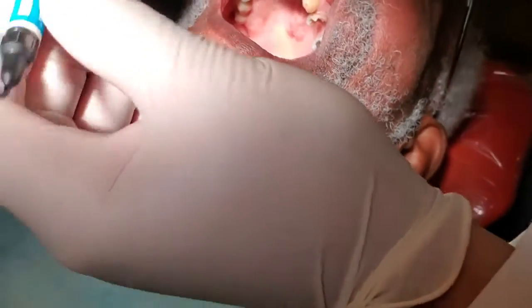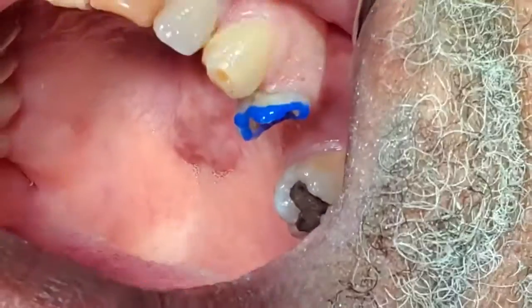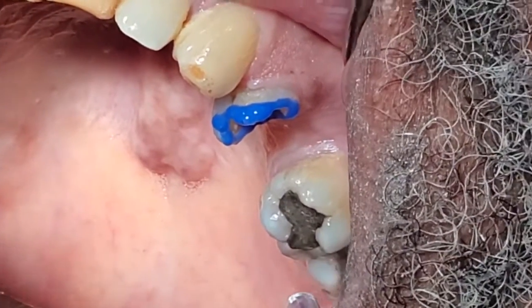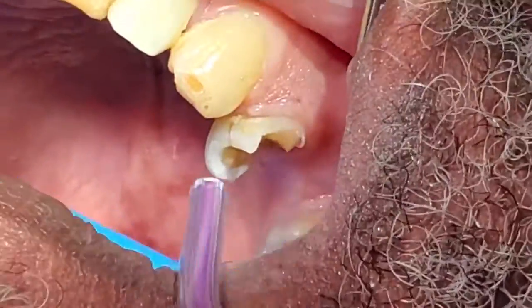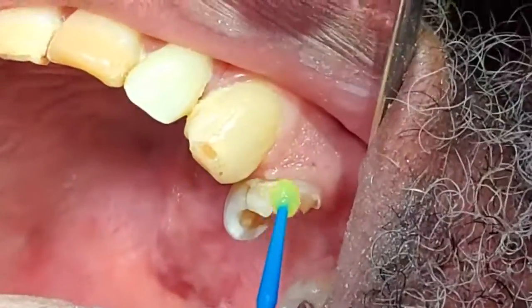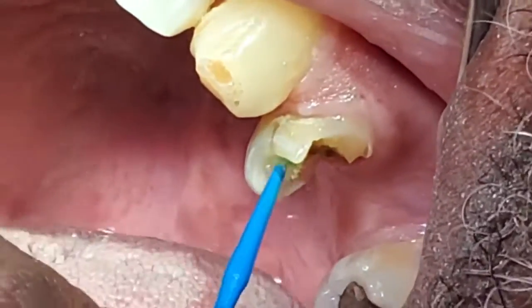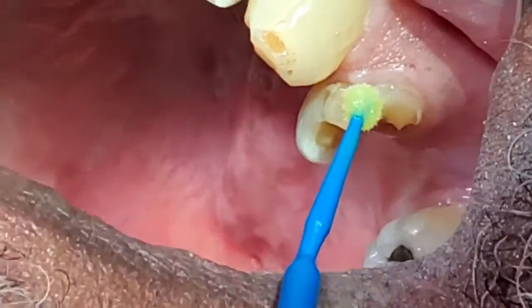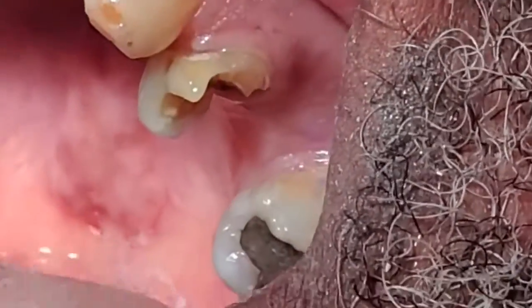It's a really incredible material. So we're going to start the procedure — we removed our amalgam, and we're going to selectively etch our enamel with some Ultra Etch. Normally I would put a matrix band on this, but I want you to see this, so I'm going to selectively etch the enamel and then wait about 10 seconds, rinse this off thoroughly, and then apply G-Premium Bond, which is GC America's universal adhesive. The trick with these universals is you need not only to put multiple layers, but you need to really scrub it into the dentin — by scrubbing into the dentin you're activating that material into the tubules and making sure you get a complete adhesive process.